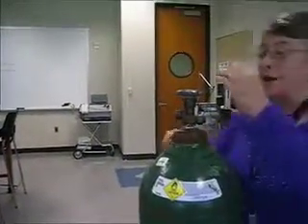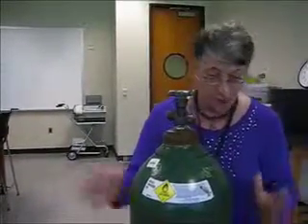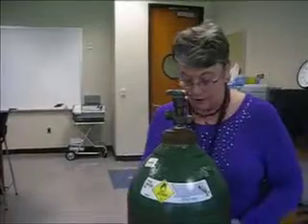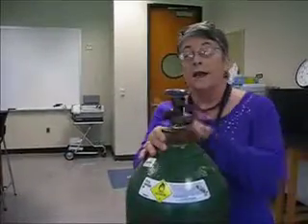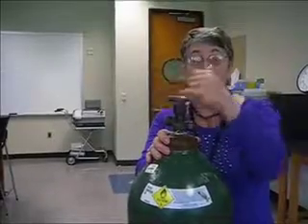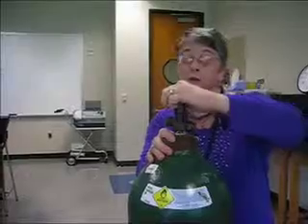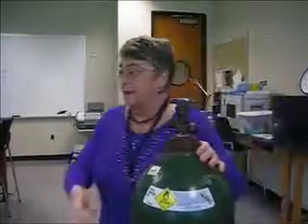Now, before I do anything, I have to crack the cylinder. Cracking the cylinder means it's got its little seat belt on, it's in its little basket, or actually we call this a cart. And I'm not putting my hand in the way because I need to get this air out. I'm going to clean out the device by cracking the cylinder. It's going to be pretty loud. Cracking the cylinder. Okay.